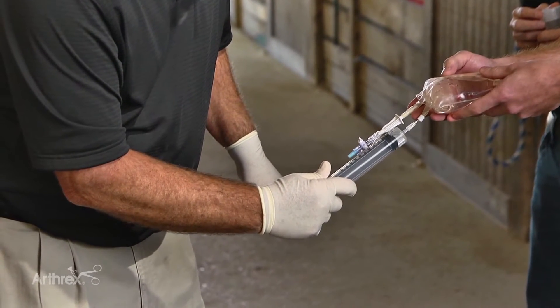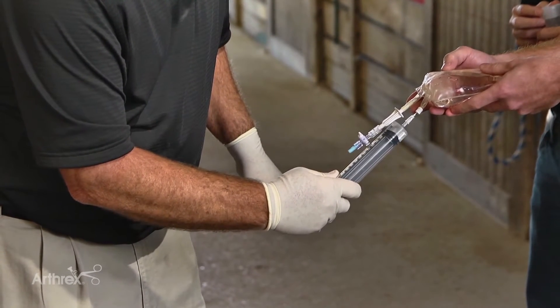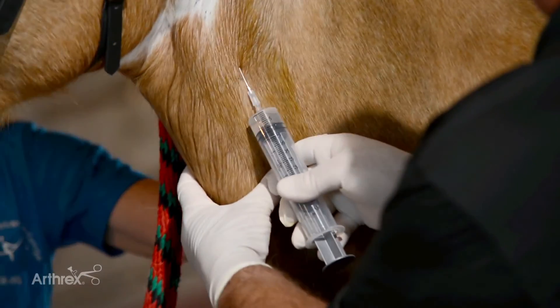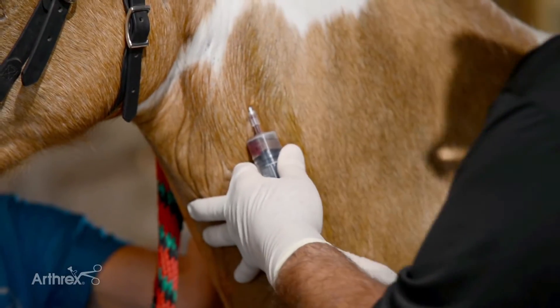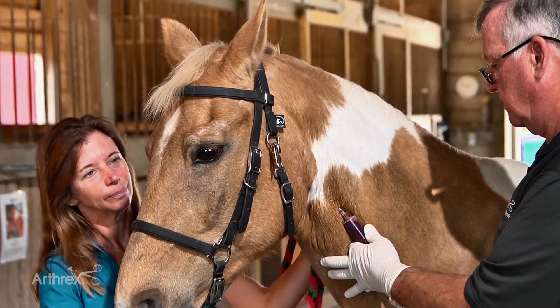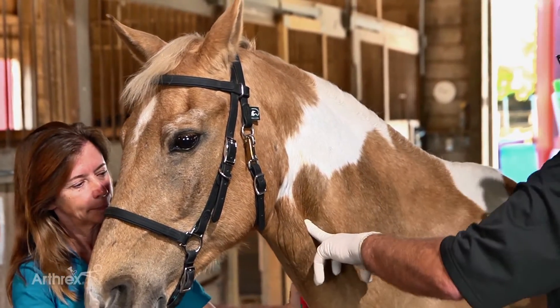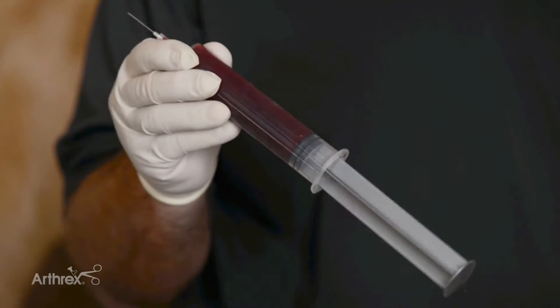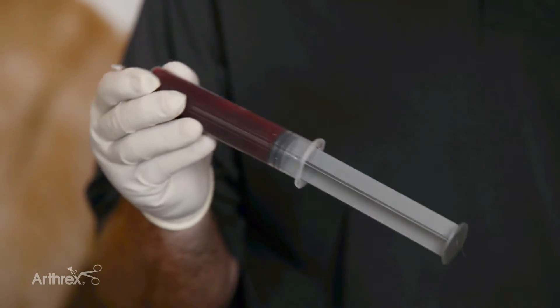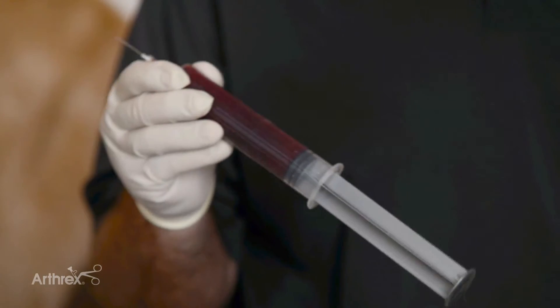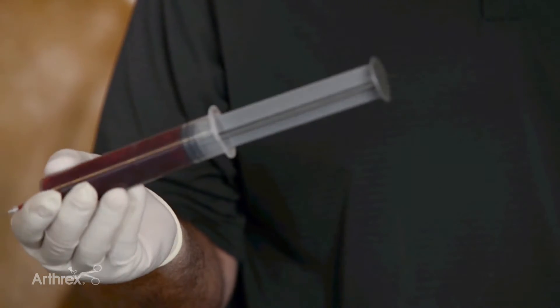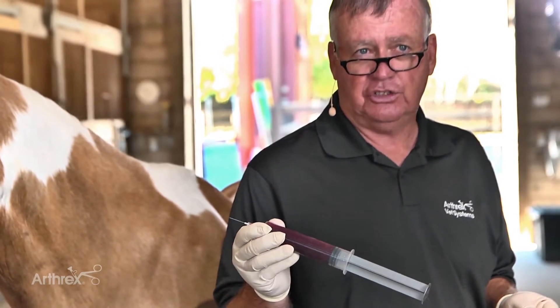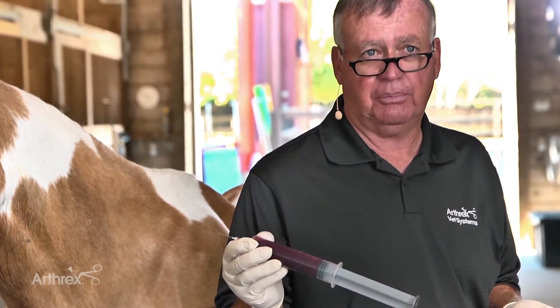So in this case we're going to do 8 cc's. So we're going to do 60 mL's of blood today. What I'd like to do is after we take the whole blood, we want to invert the syringe several times to make sure that we get the ACDA mixed up with the blood properly. After this we go ahead and inject this into the Angel apparatus.